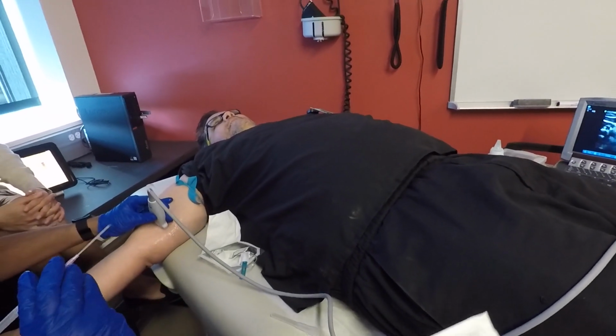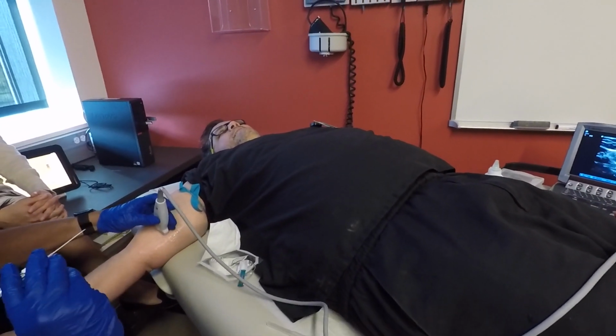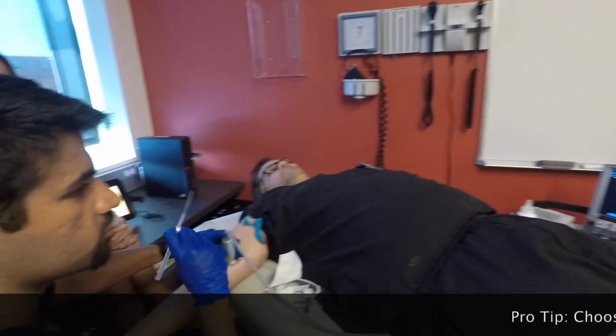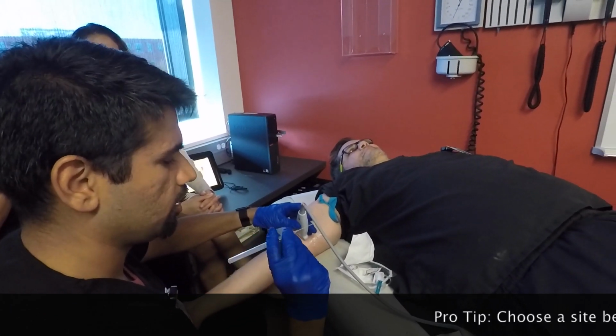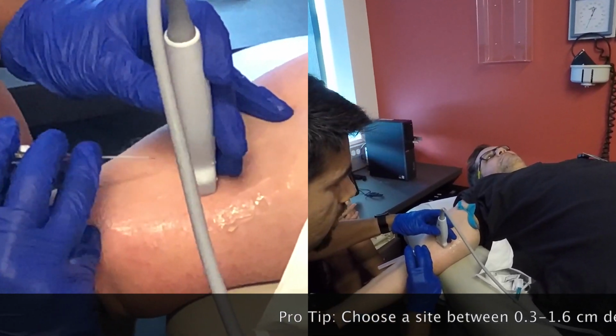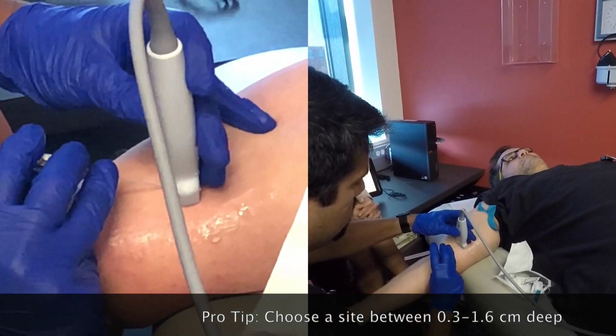Now, the thing about site selection is you want to make sure that you choose the largest target that you can find. Right here, Dr. Byrne? Yeah. And you want to choose a target that's between 0.3 and 1.6 centimeters deep, because that gives you the highest likelihood of success. All right, so you're going to feel a big poke. 1, 2, 3.